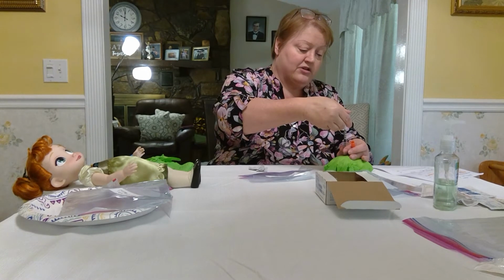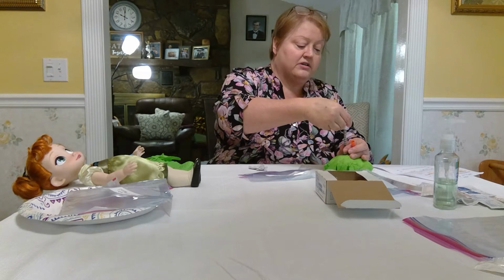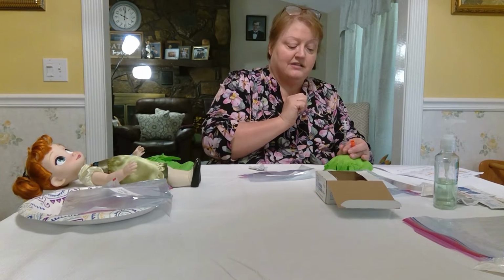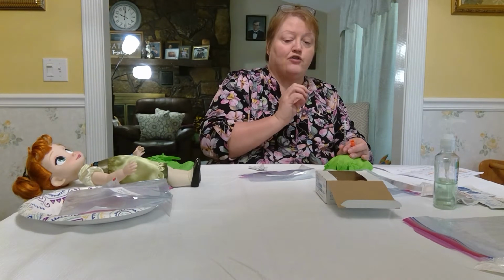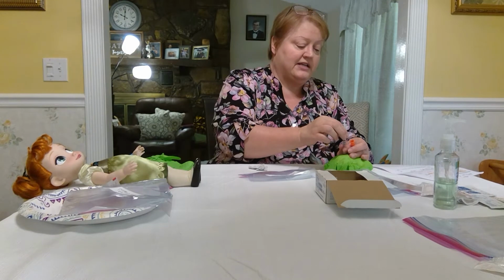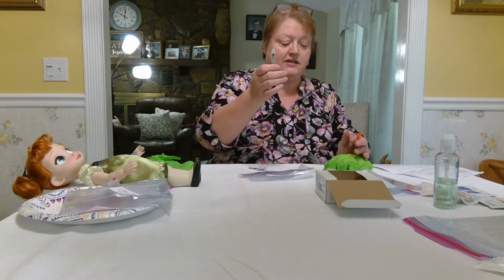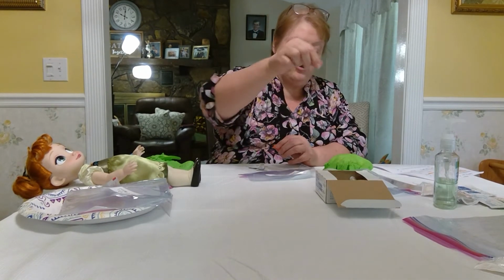So I'm going to support it with my fingers as I inject slowly the medication. Now your book does not say this, but the books in the past and what we have always taught is that once you have injected, wait 10 seconds, count 10, before you pull it out. That will allow it not to follow the track out and lose some of the medication. So count to 10, remove, activate, and you have now given your insulin, and discard of it into your needle box.